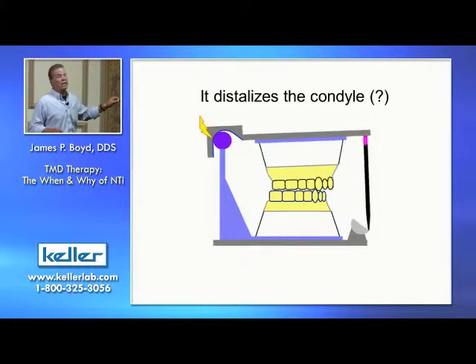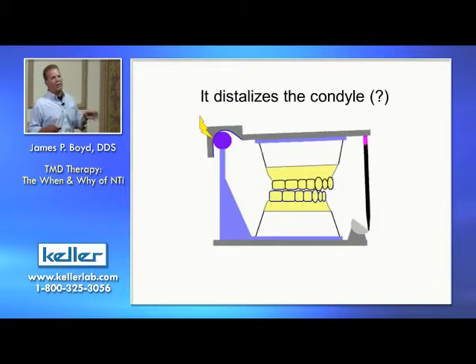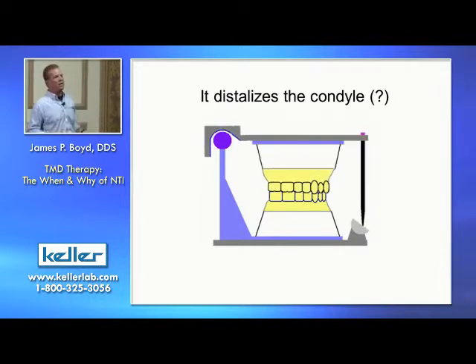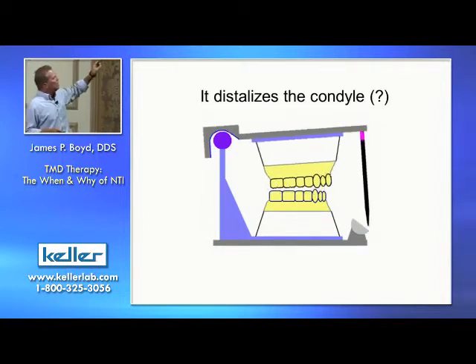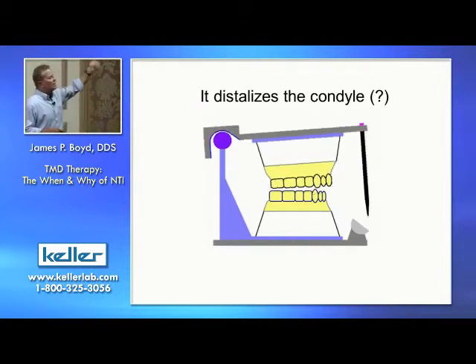And if you went to Southern Cal where I went, where it's hot in the summertime, you do a full arch wax up, you never let those teeth touch the lower model at nighttime. You've got that incisal guide pin because it just melts, it gets so hot. So you drop the incisal guide pin down, boop, boop, and all of a sudden the condyle seems to be going distal into the fossa.